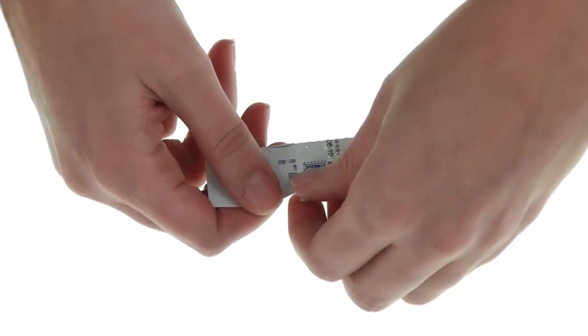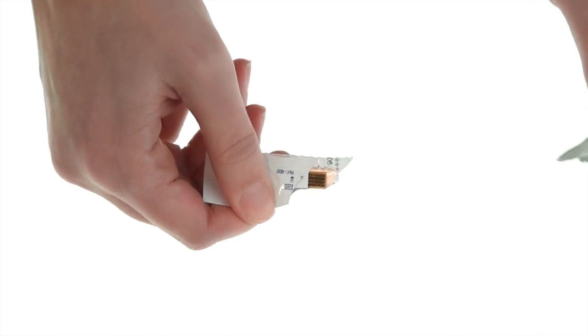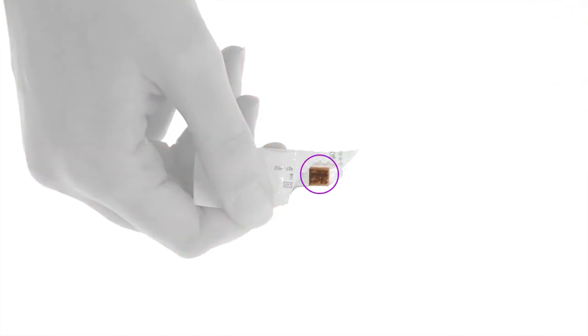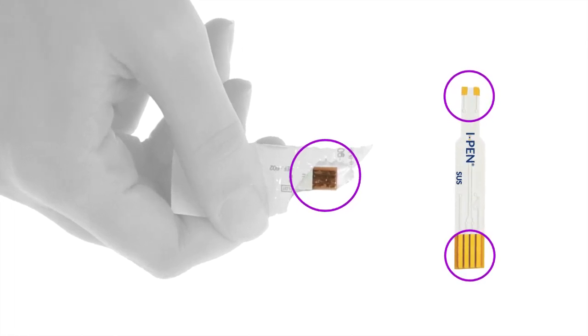Grasp the bottom of the package sensors firmly with one hand and carefully tear in the direction of the pre-cut section to expose the end of the sensor to be inserted into the iPen device. Do not touch the exposed gold electrodes on the tip of the sensor when inserting the sensor into the device.